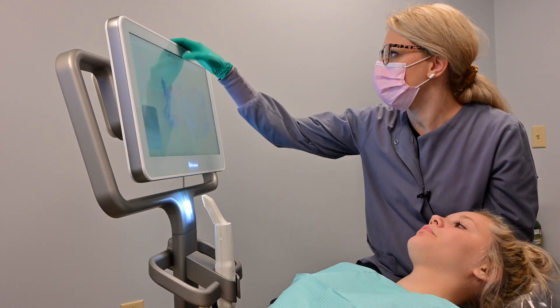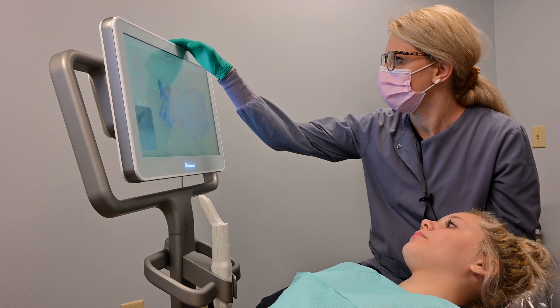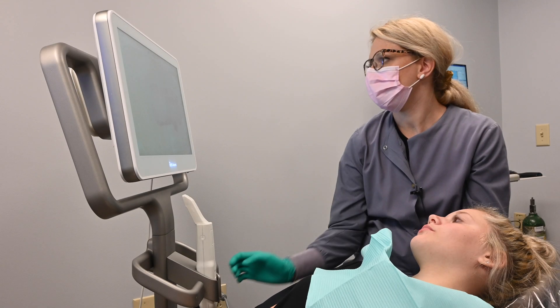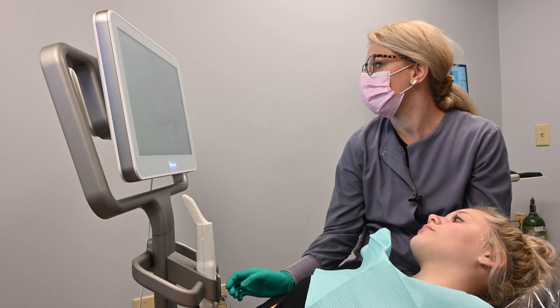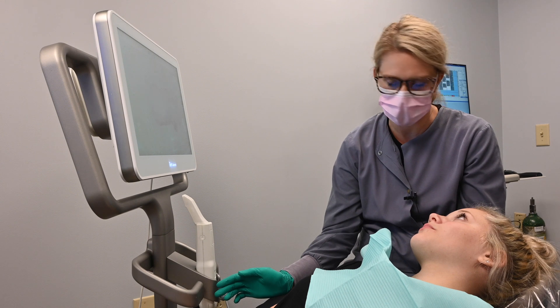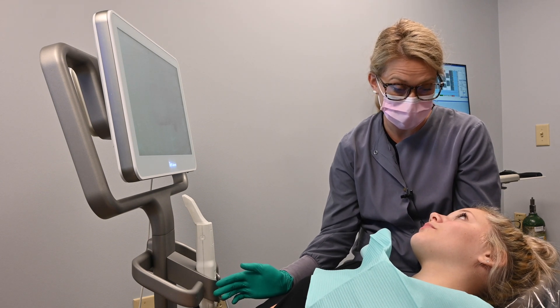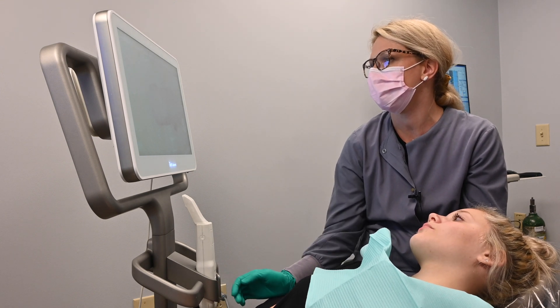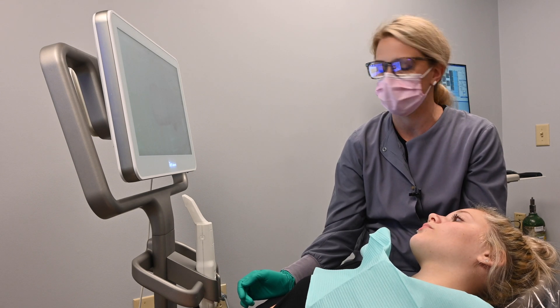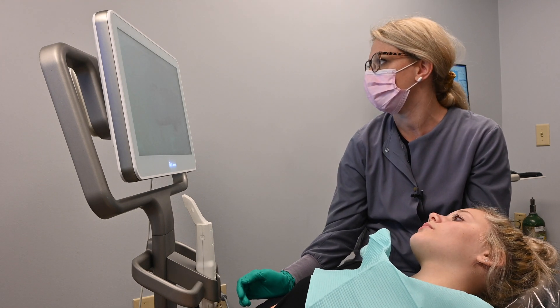Now that your scans are done, we're going to go ahead and process it. We can also use the iTero for crowns and implants — it scans and sends to our lab where they can digitally make your crown on a program, and then it gets sent off to a milling company and sent back to us for shading. Everything we do on iTero is used in-house here to help design whatever treatment you would be going for.